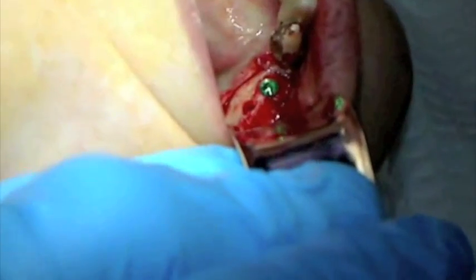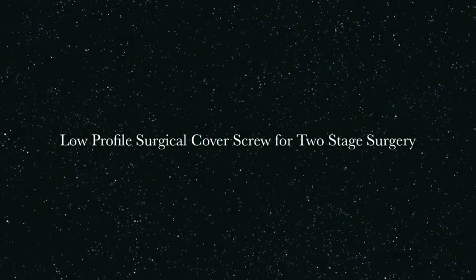The transfer abutment is then removed with a 1.25 mm hex driver. The internal hex of the implant is then sealed with a low profile cover screw.